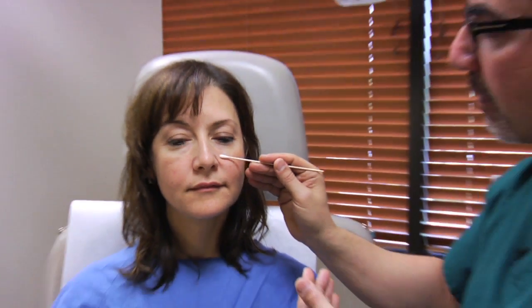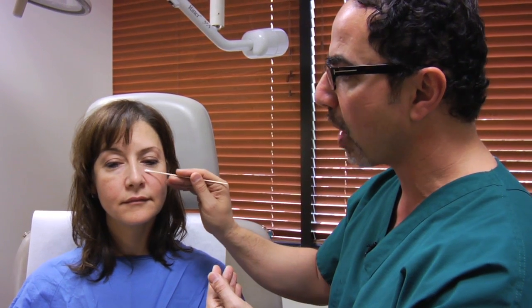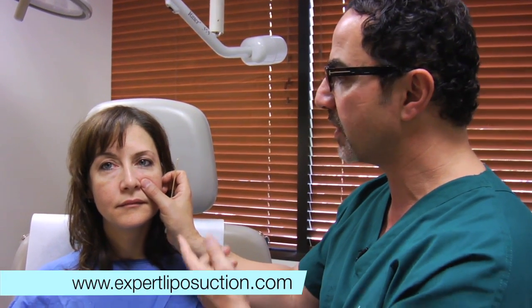How you're looking at light is very important. I see too much highlight here, and I see too much shadowing over here. So we're going to replenish volume in Jacqueline's case, a little up in the temple area, a little in the lateral cheek area. A very important area to do in Jacqueline's case is this lower eyelid tear trough, as we call it, and the upper middle cheek area to make the cheeks more lifted, so that she's got beautiful eyes, but this shadowing below her eyes really takes away. So the fat transfer in her upper middle cheek area and lateral cheeks is very important to do.